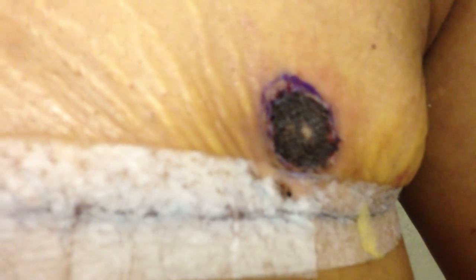So now I'll just dab this little bit of area here where there's a little bit of discharge — but that's stunning, it looks absolutely perfect. So now we're ready for side two.